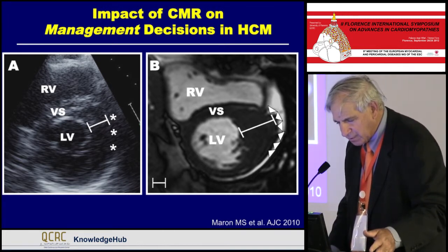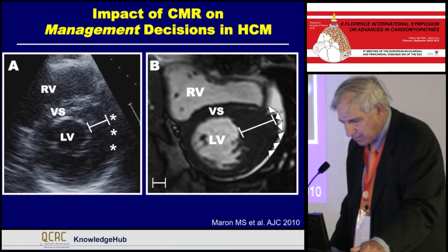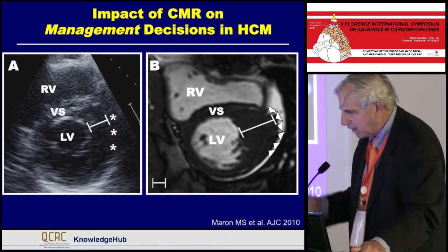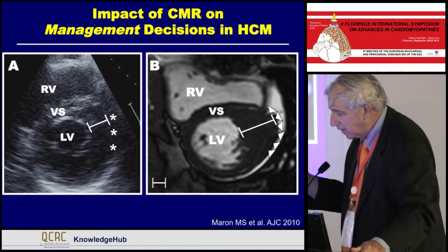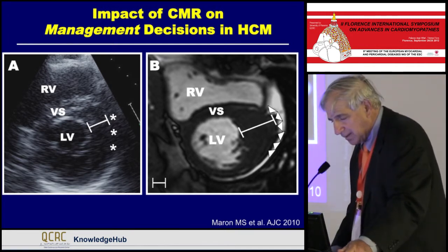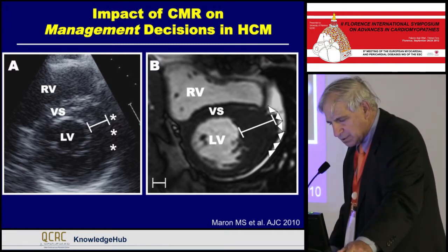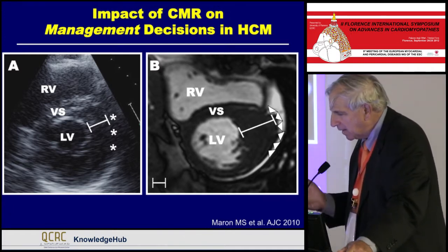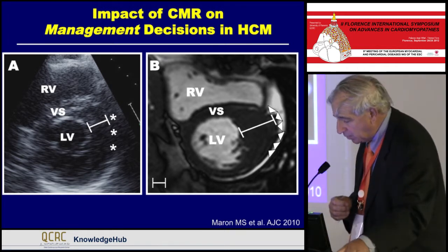The echocardiogram over here shows hypertrophy. It's diagnostic. There's no question this is a patient with HCM who has some hypertrophy spilling over into the anterior lateral free wall. You apply the CMR, and all of a sudden, it turns out that there is substantial, if not massive, hypertrophy in this area. Now, how did that happen? Well, you know, for years, we have always assumed that this margin here was an interface. It sort of looks like it should be where we have indicated it, but it's not. It's the epicardial margin, it's not the endocardial margin, which is much more discrete.